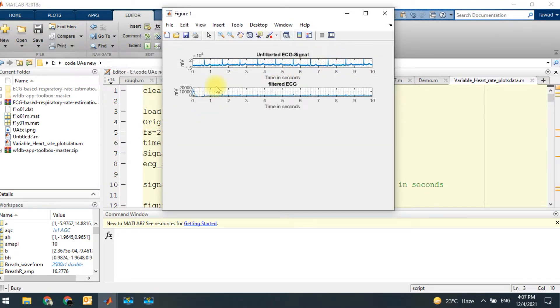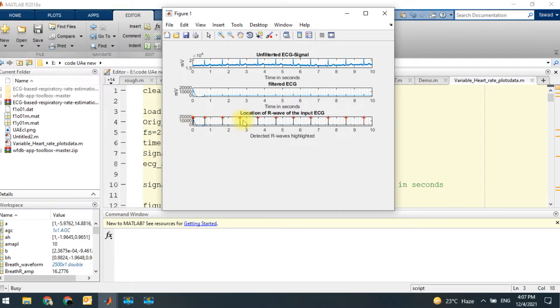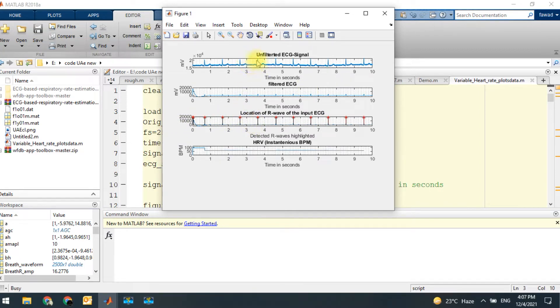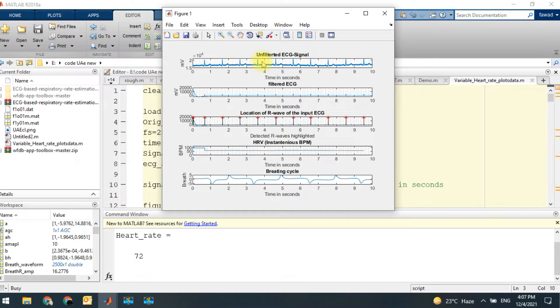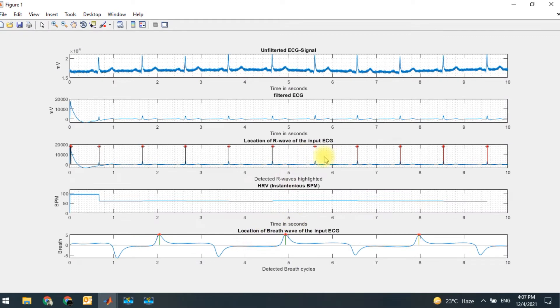The original unfiltered ECG and the filtered version of the ECG are shown. These are the R waves where the spikes are located. These markers represent the cardiac signal R wave positions. After that, these are the heart rate variability — the heart rate is increasing and decreasing, and the low-pass waves are represented in such a way.